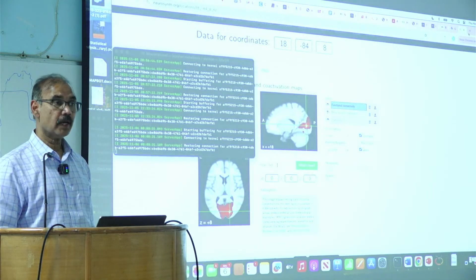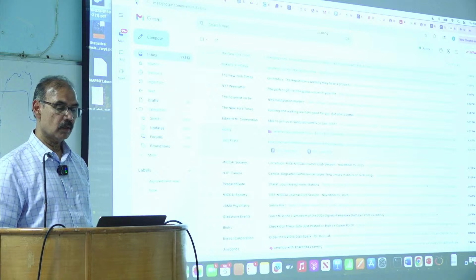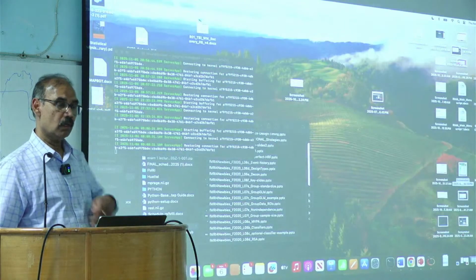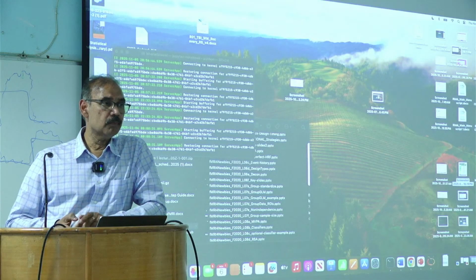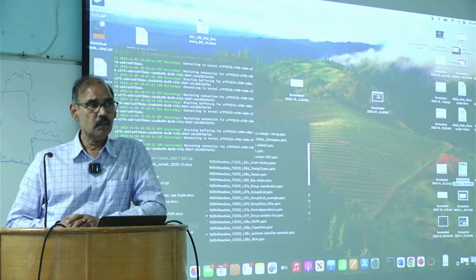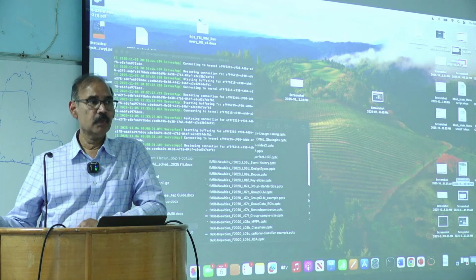Yeah, I have one question. Why do we extract this time series from the mask image instead of the brain? We extract the time series from the brain regions using the mask, but the mask is instead of the brain. So I'm asking why do we need to extract the time series from the mask instead of the brain?